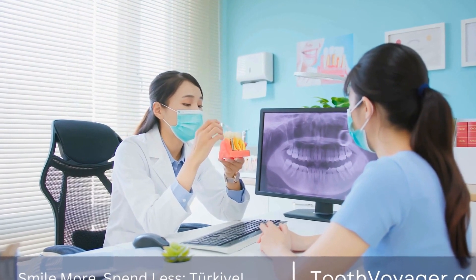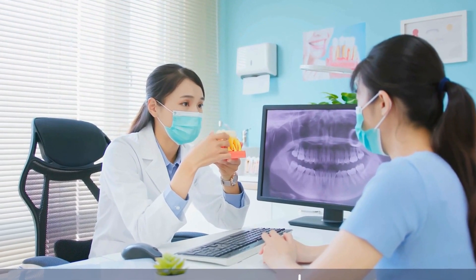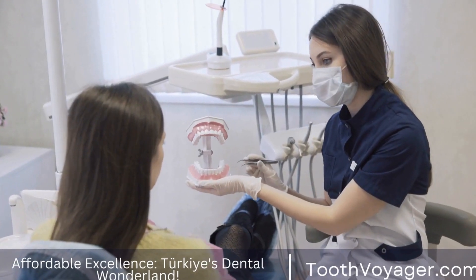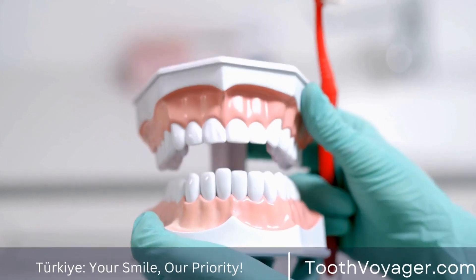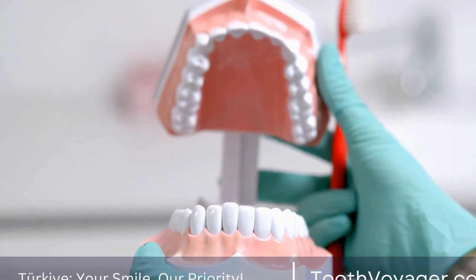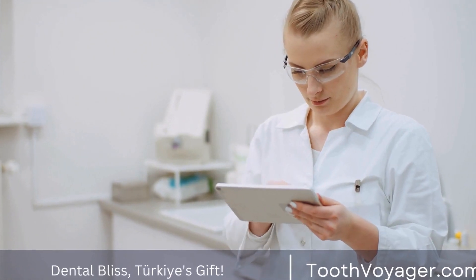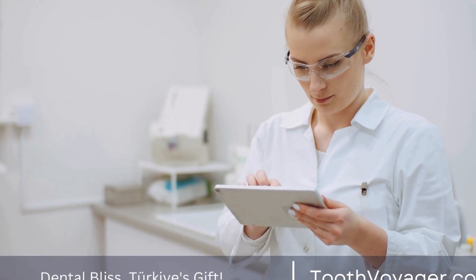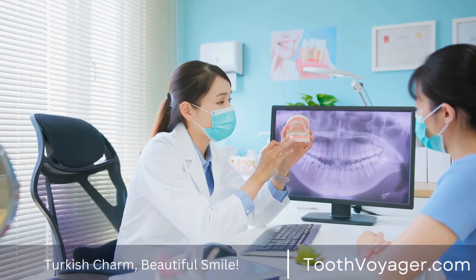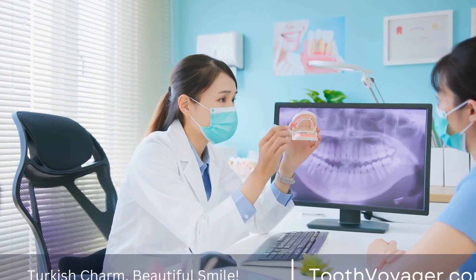In this video, we will take you through the journey of dental veneers, from concept to smile. Concept and Consultation: The process of creating dental veneers begins with a consultation with a dentist. During this initial appointment, the dentist will assess the patient's dental health and discuss their goals for improving their smile. They will then take impressions of the patient's teeth to create a custom treatment plan.